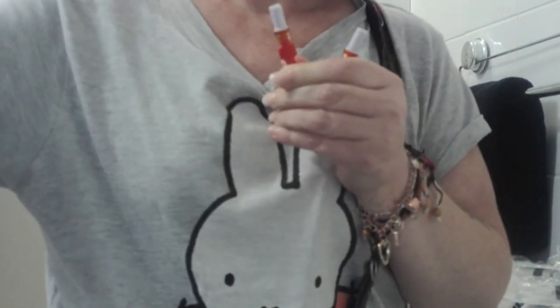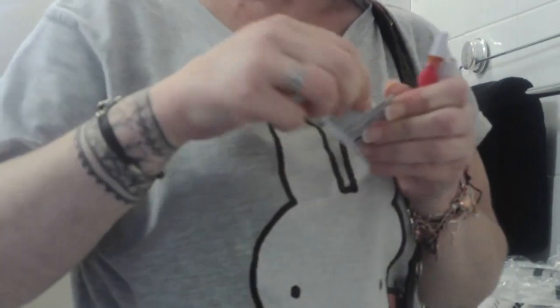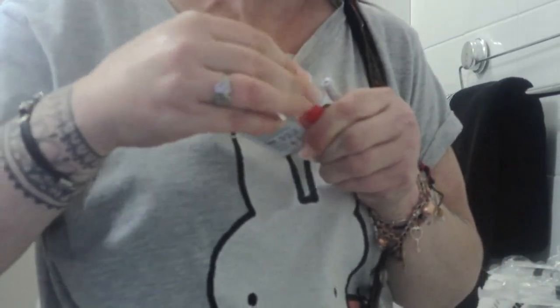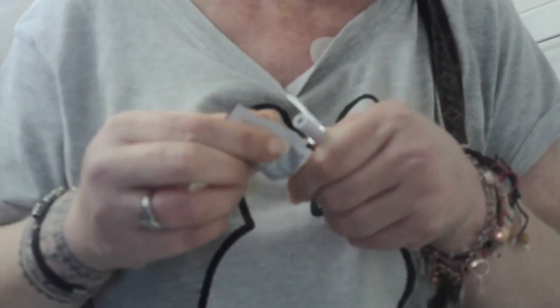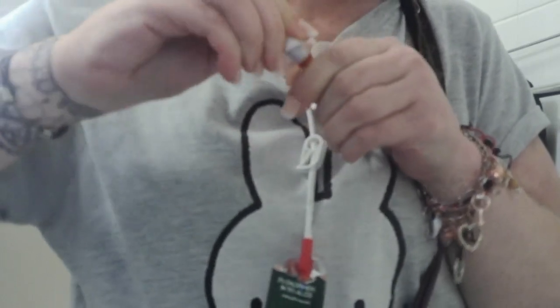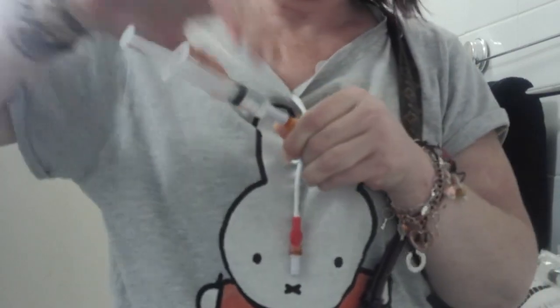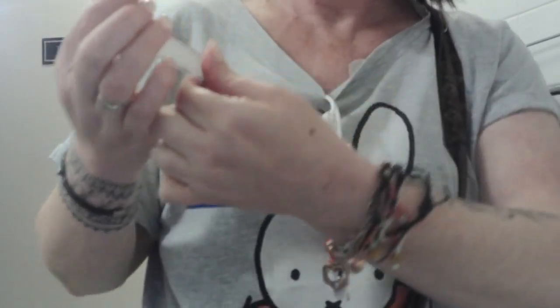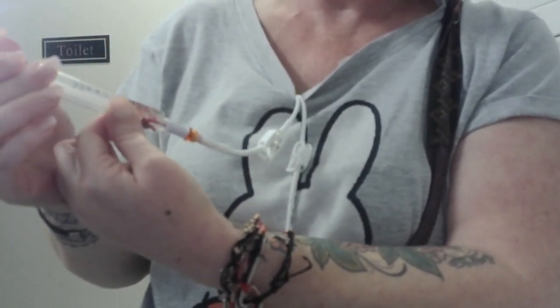No sorry. Right, here's a little trick that I use now. Because as I said, I'm going to aspirate with the one syringe. So what I do, I put that in there, like that. Undo my cap, and I'm going to flush a bit in, and I'm going to take a bit out very gently because the line's a bit funny.